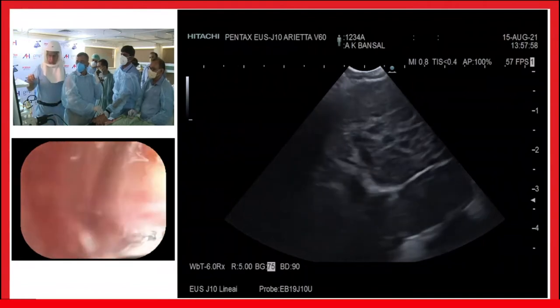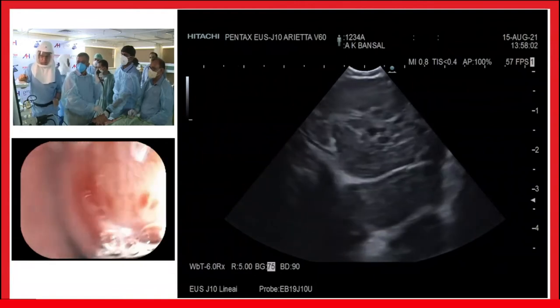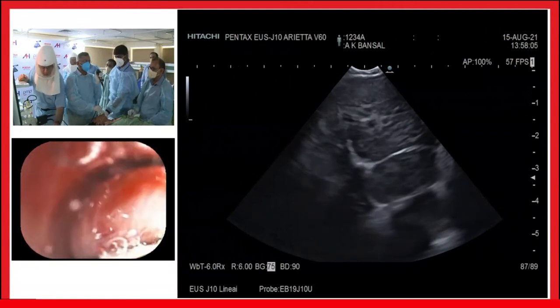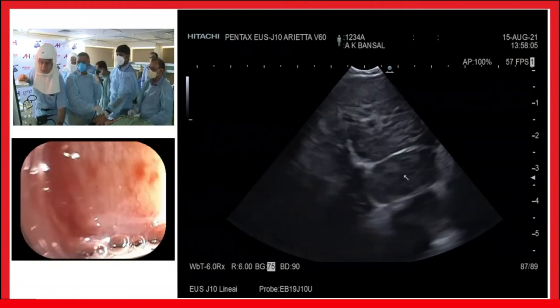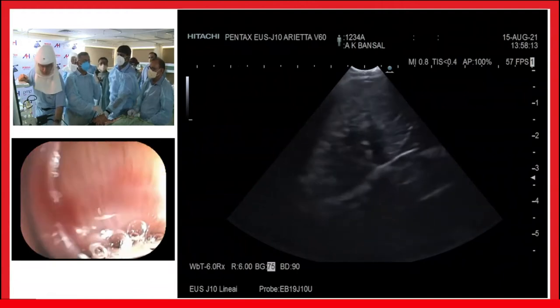It's a non-homogeneous lymph node. You can pretty much see that it is a conglomerate of lymph nodes. It is not just one single lymph node. The last one is about the vascularity. You can see quite a lot of vessels inside the lymph node. That's called a central intranodal vessel sign.